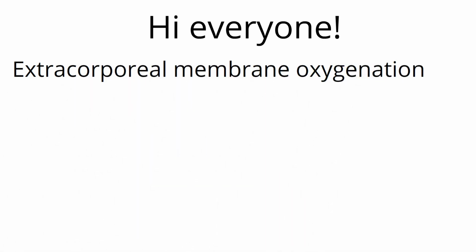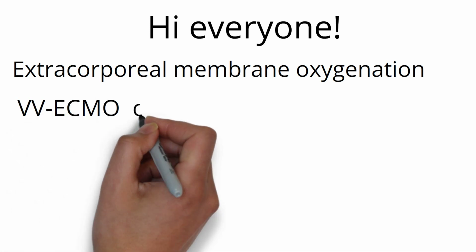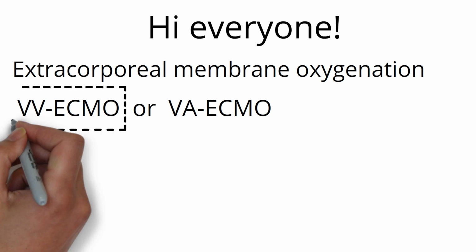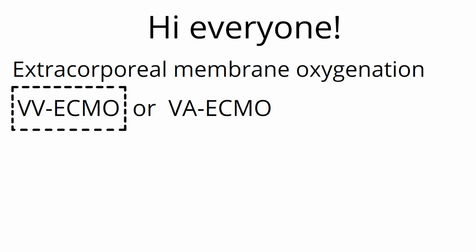Today, we are going to learn the basics of ECMO, or extracorporeal membrane oxygenation. There are two types of ECMO, veno-venous, or VV, and veno-arterial, or VA ECMO. We are going to focus on VV ECMO, which is used to support patients in refractory respiratory failure.